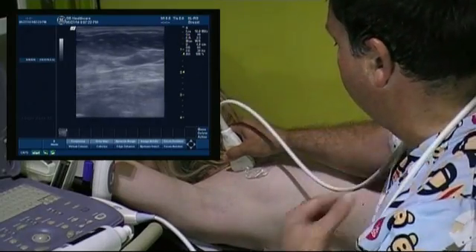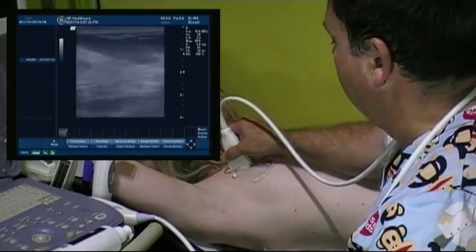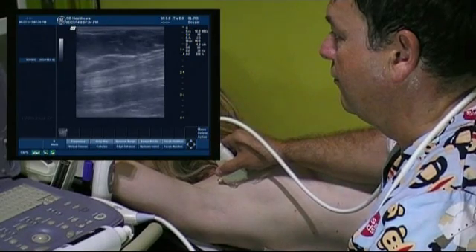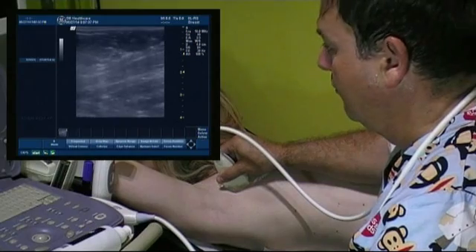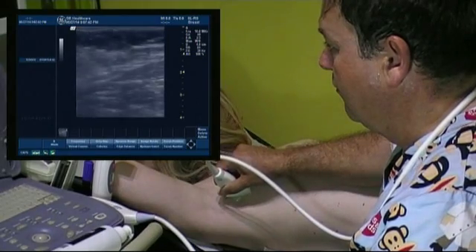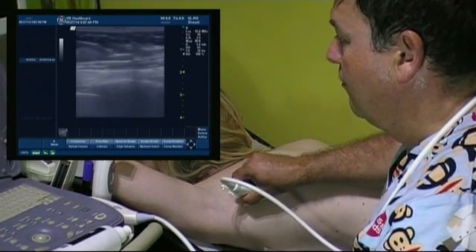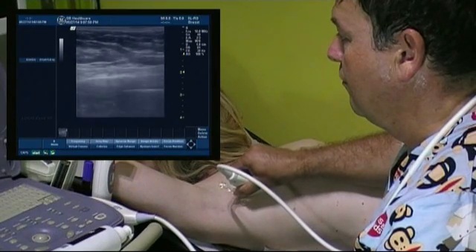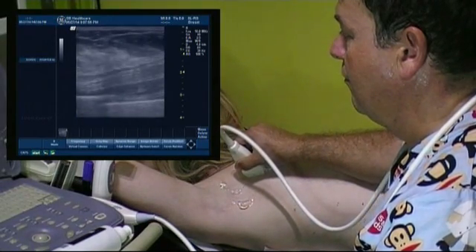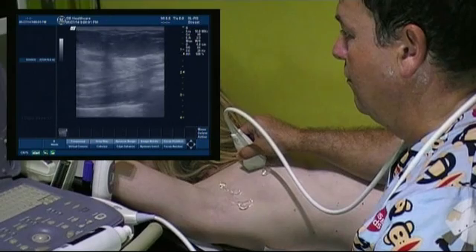We start by applying the probe vertically to the skin at the 12 o'clock position on the nipple area and then move upwards until we reach the edge of the breast. Then we move laterally towards the edge of the pectoral muscle. Then we move gently towards the sternum, observing the harmonic movement of the structures, looking for anything that breaks this continuity. We advance to the medial part of the breast and follow this plane until we reach the parasternal area.